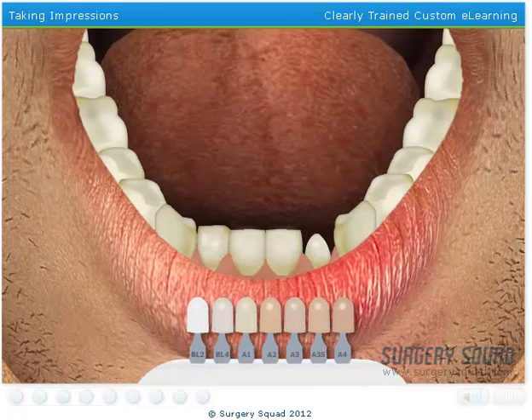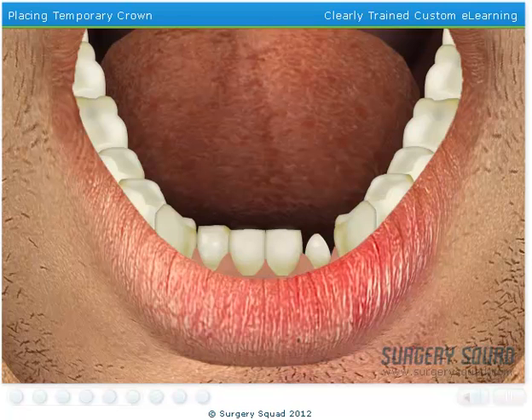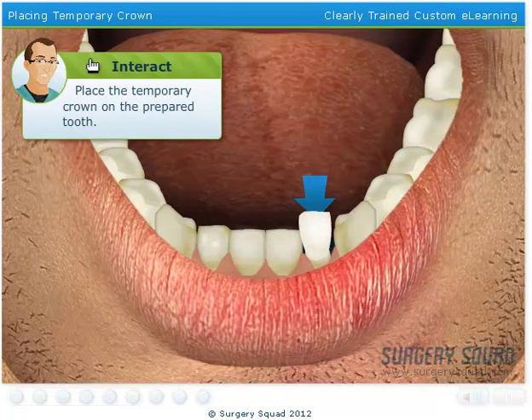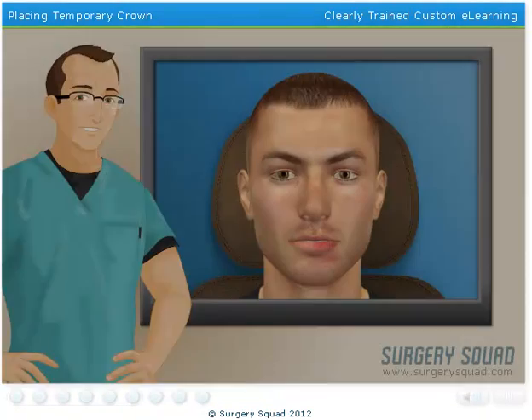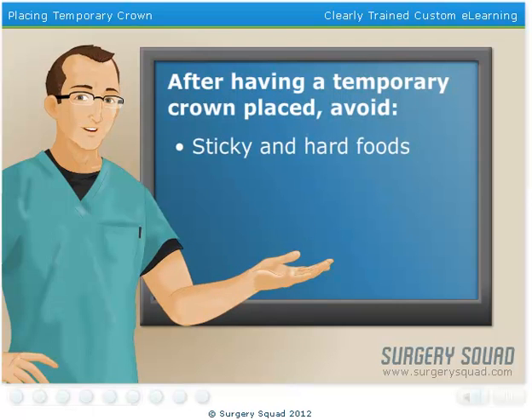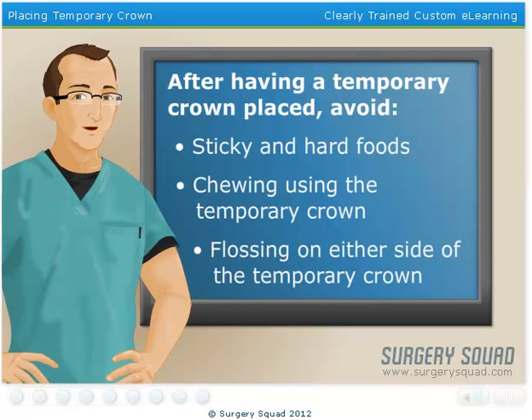That looks like a match. The last item on today's agenda is to place the temporary crown. The temporary crowns that we use are prefabricated and made of plastic. I've already lined the inside of the crown with temporary cement, so go ahead and place it on the prepared tooth. Since it's only a temporary crown, there are some guidelines our patient will need to be aware of before they go. They need to avoid sticky and hard foods, try not to chew using the temporary crown, and steer clear of flossing on either side of the temporary crown, as they may unintentionally pull the crown off the tooth.